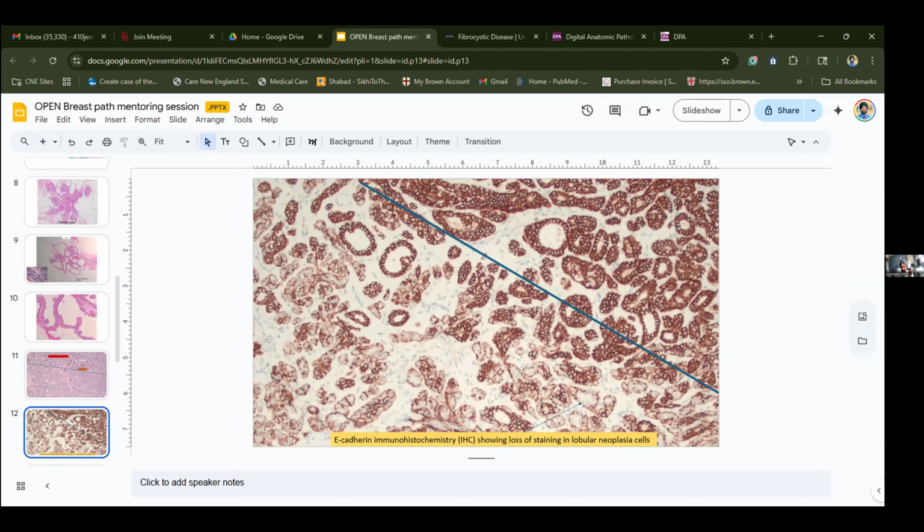So this IHC, I don't know if you were exposed to IHC, maybe very early, but there are pictures, there are scanned slides. How do you use immunohistochemistry? Usually the positive signal is brown. I would ask you to pay attention, where is the brown? So in this particular case, it's E-cadherin.